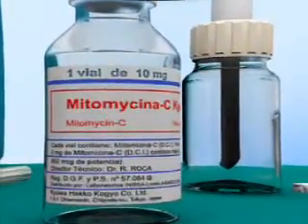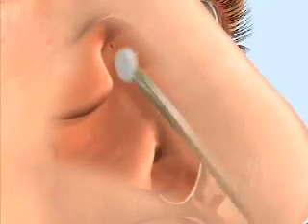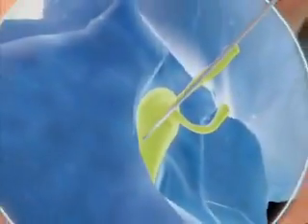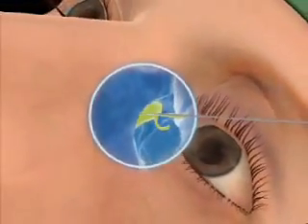We have recently begun using mitomycin, as it has a potent inhibitory effect on fibroblast proliferation of the soft tissues surrounding the area of the new osteotomy. Apart from these innovations, our line of research is currently looking at obtaining tissues that allow maximum absorption of the light energy delivered by the diode laser, thereby enhancing its action to allow shorter exposure times.